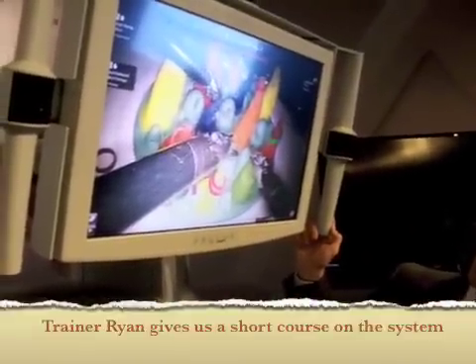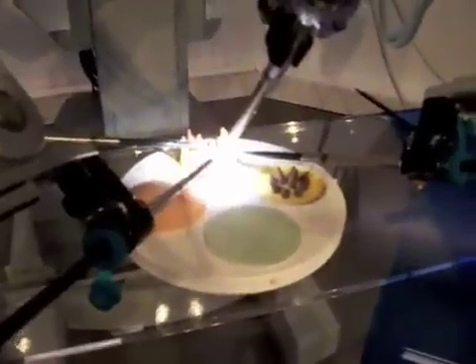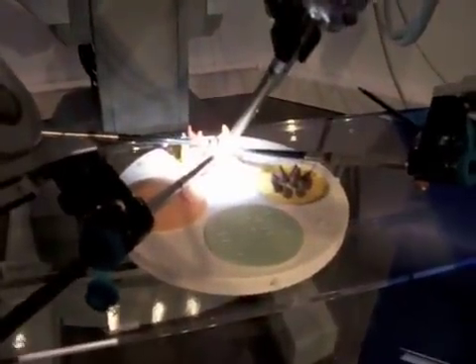Jim, it looks like your left hand shouldn't move. Perfect. Now with your right hand, just loosen your hold so it's nice and delicate — a nice light hold.